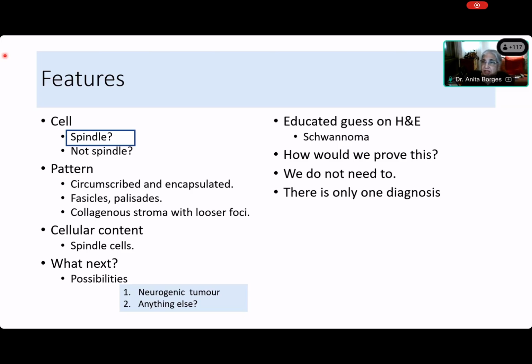So I didn't agree with Kedar because all you students have DDs. You do not need a DD if there is no DD. What is DD, Saida? Differential diagnosis. Yes. So everyone wants a DD. You don't need a DD if there is only one diagnosis, and this is a schwannoma. Have you understood that, Saida? Yes, ma'am.